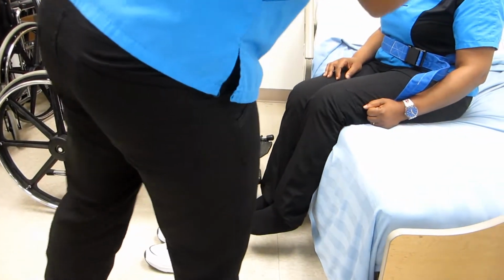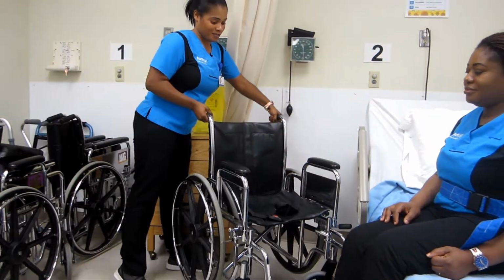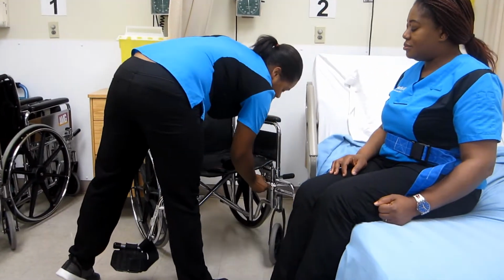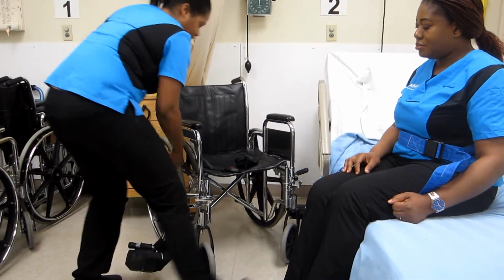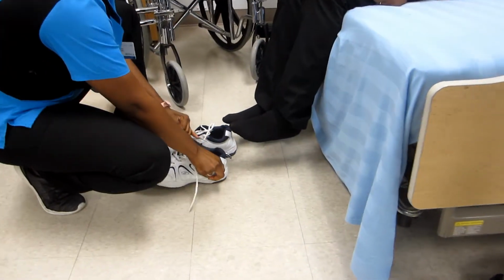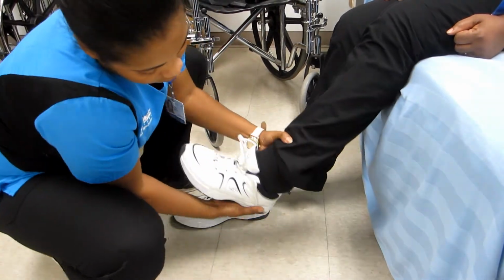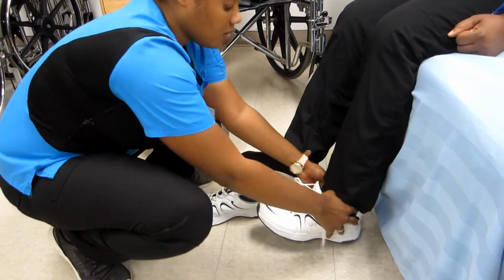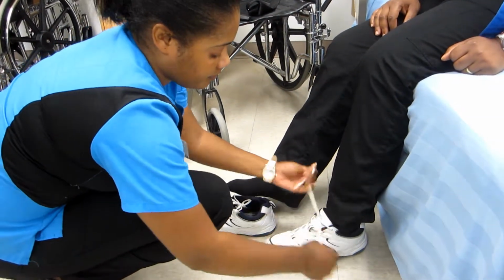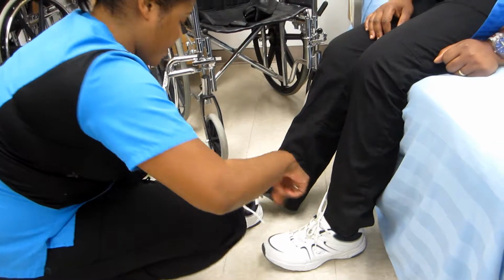I'm gonna clean my hands again because I touched your shoes. Position the wheelchair right there. There we go. And at any time, let me know if you start to feel dizzy or any headache, okay?